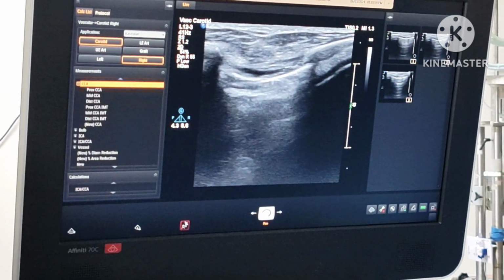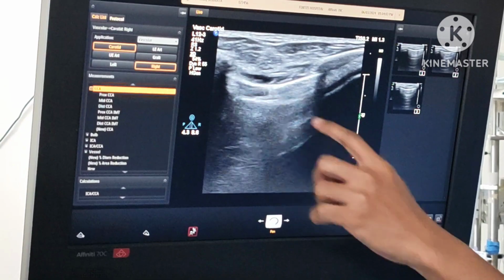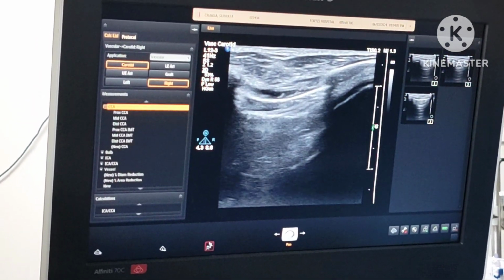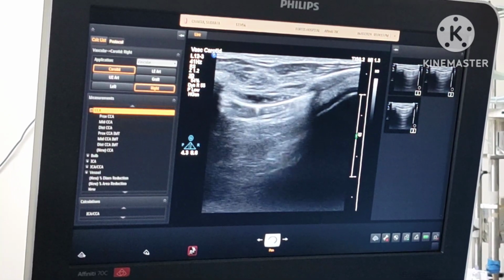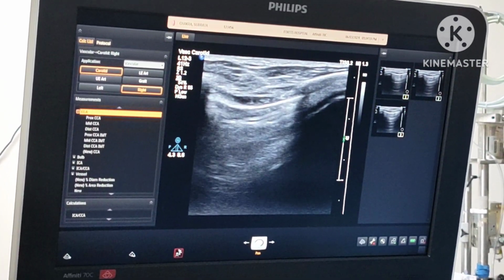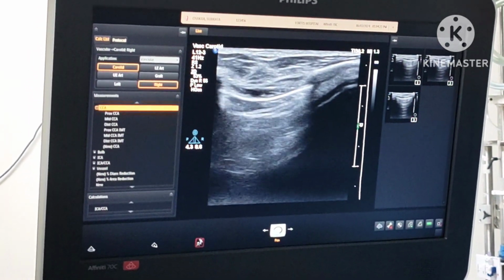Dr. Kong, can you show me the lung sliding on the image? You can see this is basically the visceral on the parietal pleura. They are moving, sliding against each other. That basically shows the lung is normally expanded and it's moving with every breath. The visceral pleura is moving over the parietal pleura, which is the normal sign that the lung is fully expanded and functioning normally.